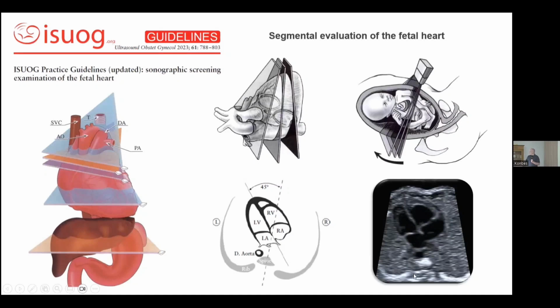On the left side here, you see the aorta, and before the aorta, there's the left atrium. You see the mitral valve. You see here the ventricle on the left side, and on the other side, the right ventricle. The myocardium is a little bit thicker, and the tricuspid valve is inserted a little bit lower compared to the mitral valve. This is the right atrium.